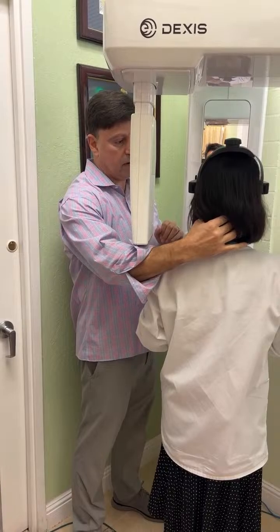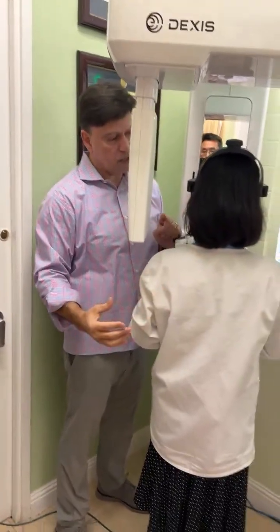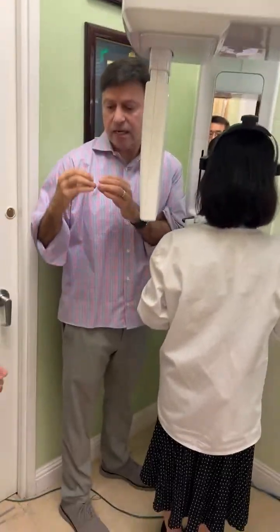Okay, so you're here. You've done swallow, tongue to the roof of the mouth, lips around the bite stick. Why?